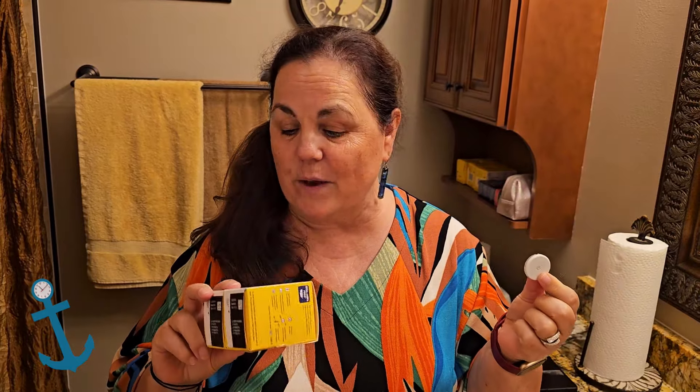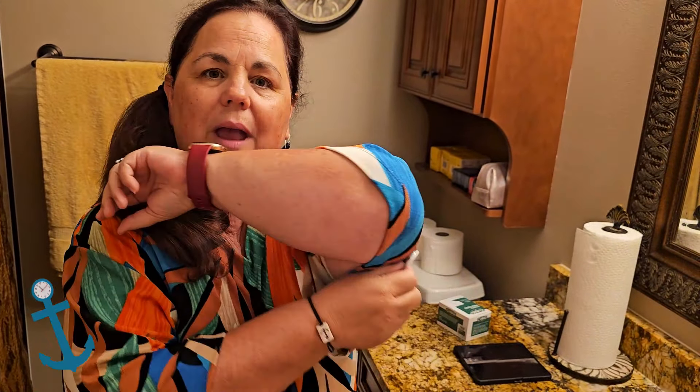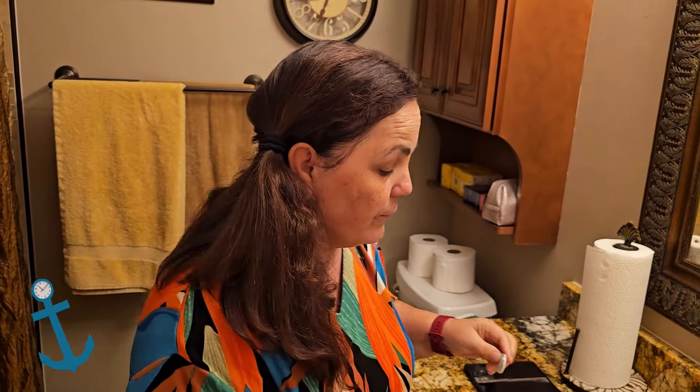The difference between a Freestyle Libre 2 and a Freestyle Libre 3 is that the 3 is supposed to be smaller. I'm going to open this up today and put it on so we'll see the difference in size. Also, when you wear the Freestyle Libre 2, other than the alarms, you have to scan the sensor with your phone — tap your phone to it — to get a reading. But the Freestyle Libre 3 constantly talks to your phone all the time, so you never have to scan because it's always being scanned and you never lose any important information about what your blood glucose has been doing 24 hours a day.